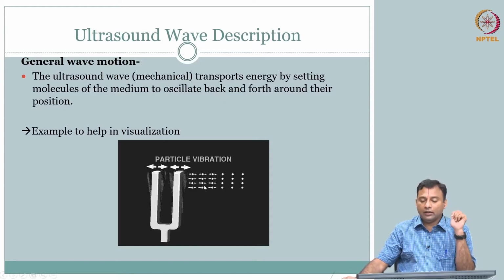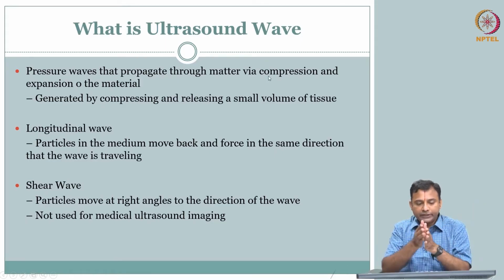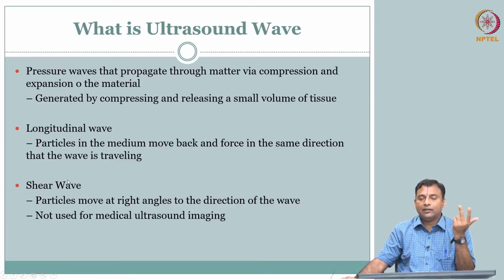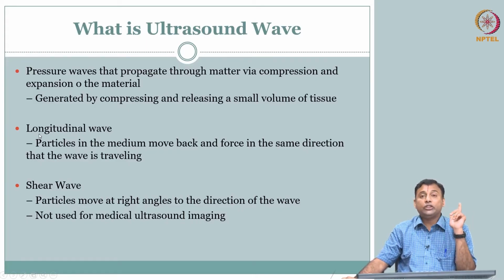Depending on the type of particle motion and the direction in which the wave moves, we can have different types of waves. A pressure wave propagates through matter via compression and expansion of the material. There are at least two types that we will recognize in this slide, and then we will move on with only one. One is the longitudinal wave.